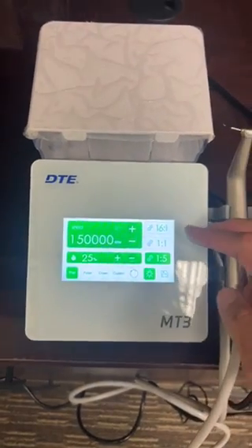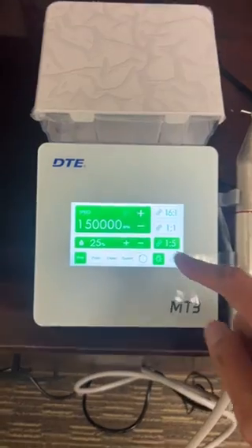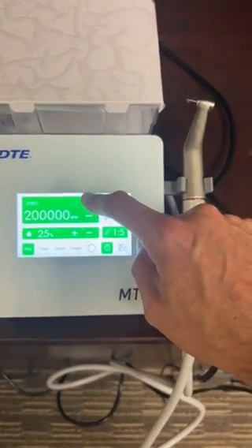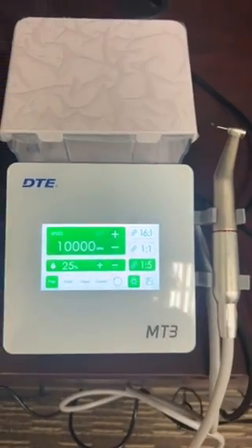It does have some pre-programmed things here, and it does come with the 1-5 in the handpiece. The RPMs go all the way up to 200,000 and all the way as low as 10,000.